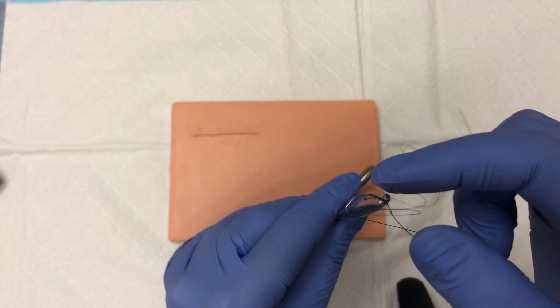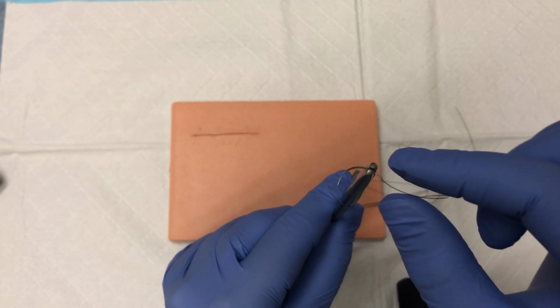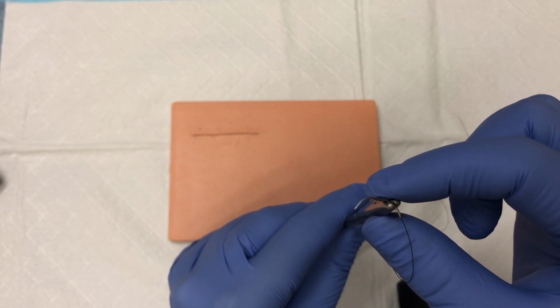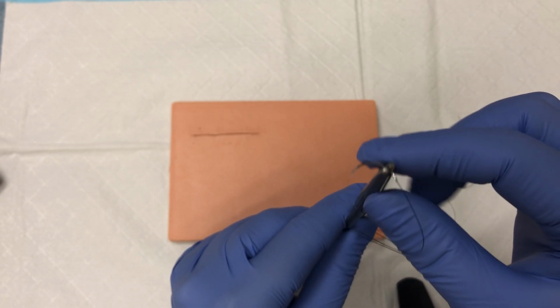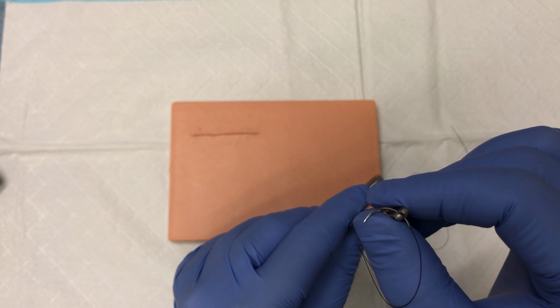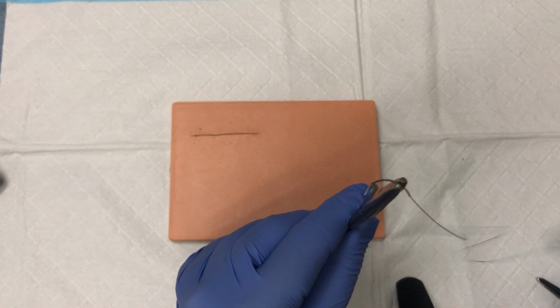Then we talk about the overall essentially arc of the needle, and you selected this needle for a reason. So therefore you want to attach the needle holder more toward the swag, but again, not on it, so that you have the entire curvature of that needle to actually use and help you with suturing this patient back together. We talk about the tip of the needle, and that's actually one of the most vulnerable points of the needle. So we never want to grab that directly with the needle driver. We would potentially bend it, and you actually can break it off. So you wouldn't want that to be a risk for a foreign body to the patient.